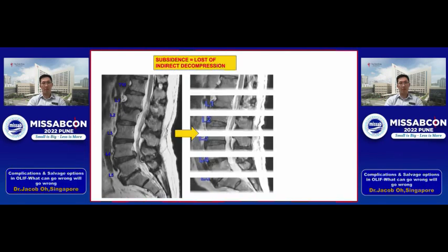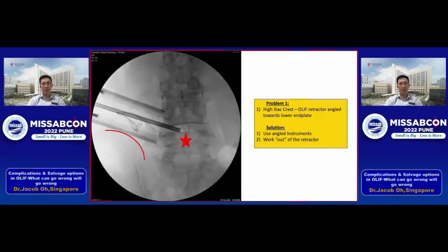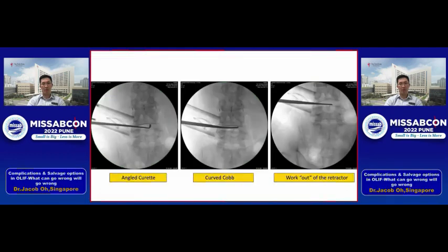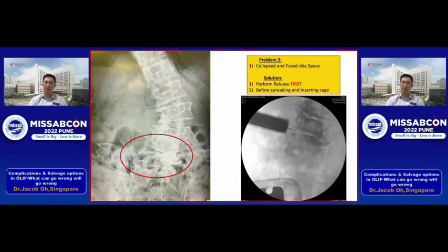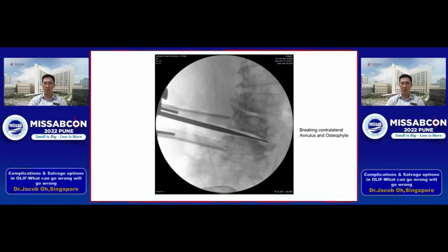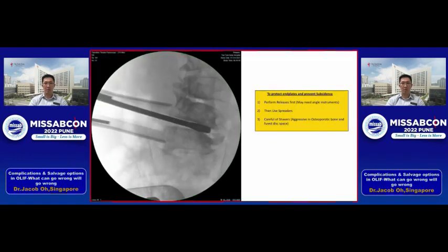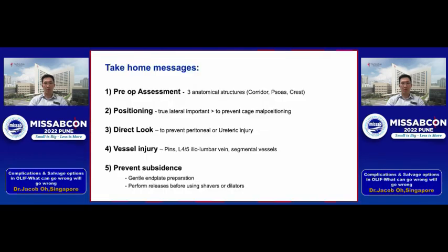How do I prevent cage subsidence? This is important because subsidence causes you to lose the effect of indirect decompression, potentially requiring the patient to return for direct decompression. A few tips: if you encounter a high iliac crest, use angled instruments — an angled curette, a curved Cobb, or work out of the retractor using the OLIF procedure. Also — and I cannot emphasize this enough — if you have a collapsed and fused disc space, perform the release first rather than just inserting the spreader and twisting it, as that will gouge out a large piece of bone. Use Cobb instruments to work contralaterally, breaking the annulus and osteophytes on the other side, and then use your spreaders to open up the space and place the cage.